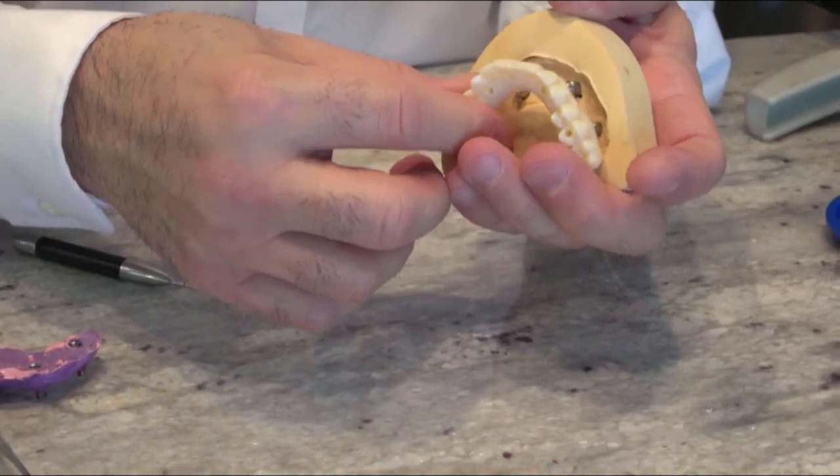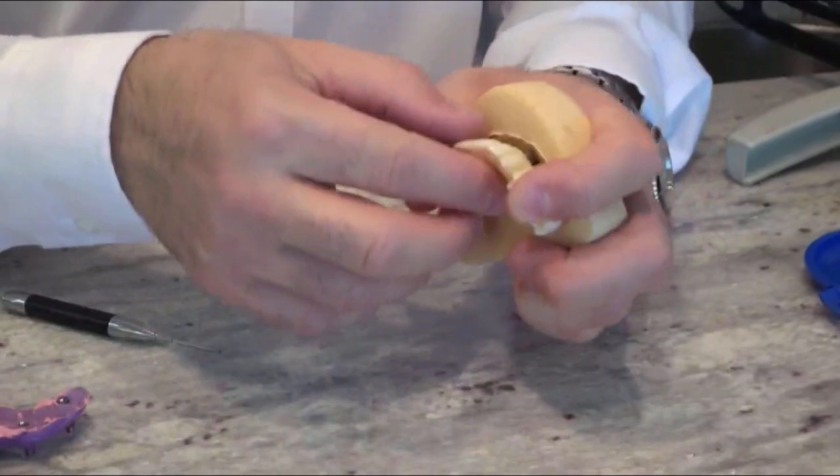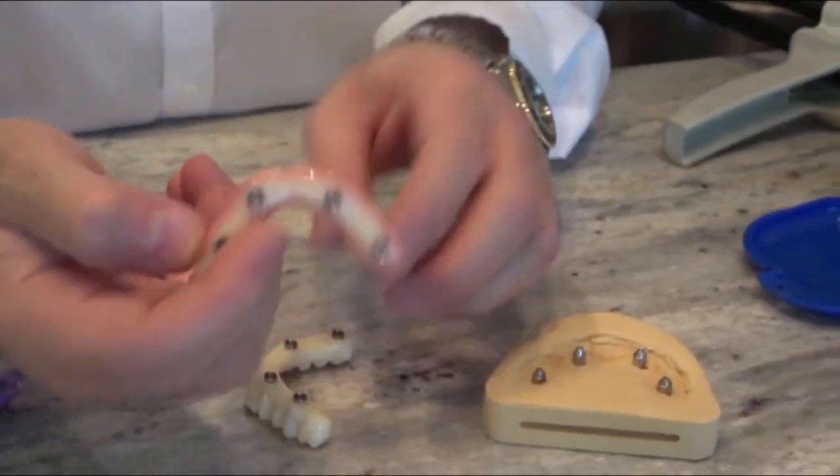Once this is tried in the mouth, you adjust the bite, check the soft tissue and tag your surface. This is the same thing but with pink composite you can see.